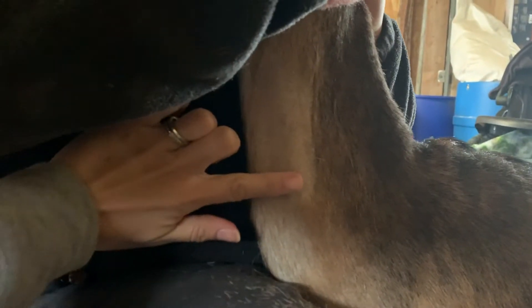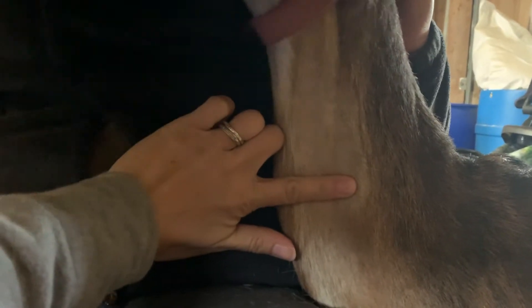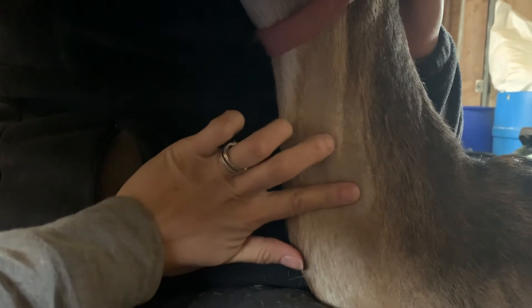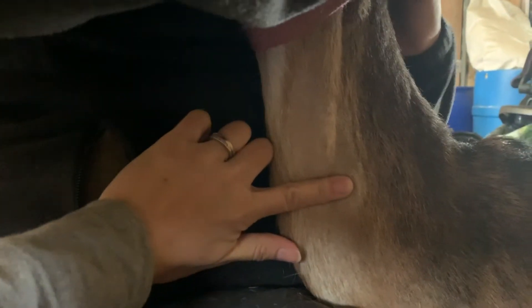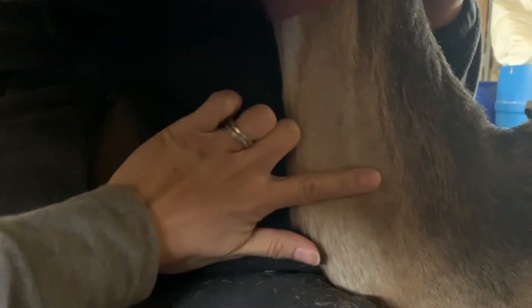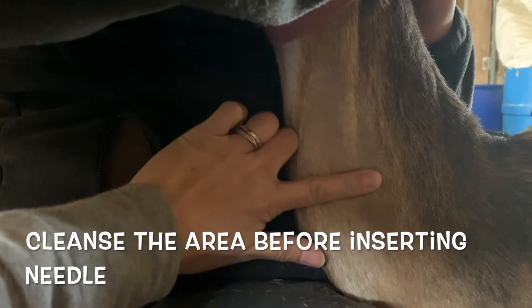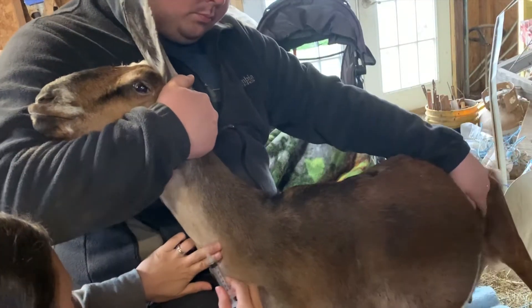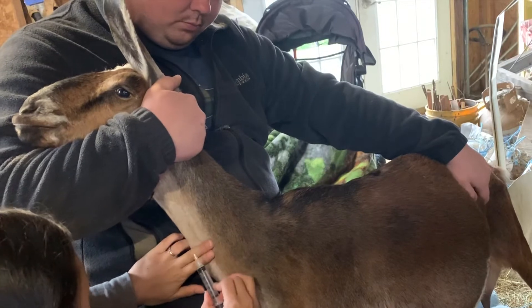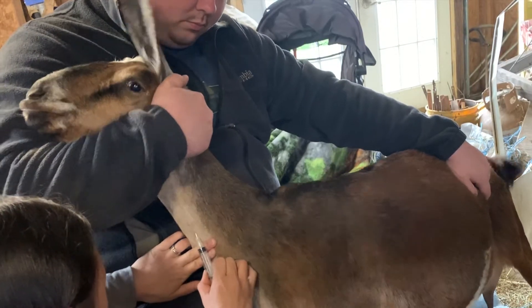What you want to do is press right where the vein is and you see it bulging out. You want to hold pressure right below the vein so you can see it bulging out and know where to draw the blood. I'm going to hold right under the vein — it's bulging out, she's getting nervous — and then insert the needle going up right into the vein.